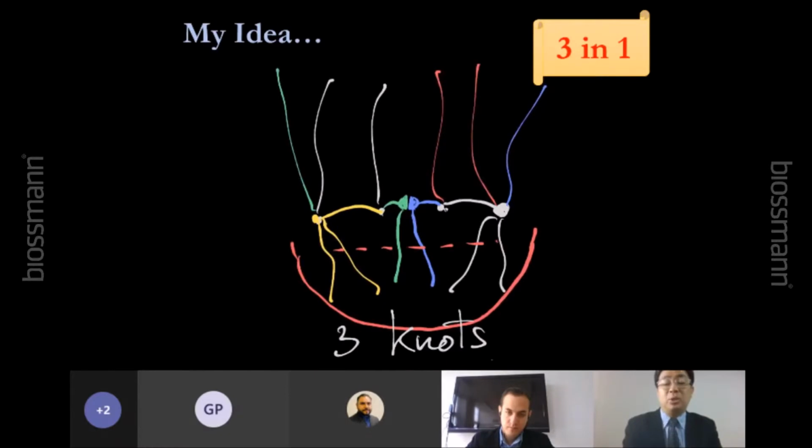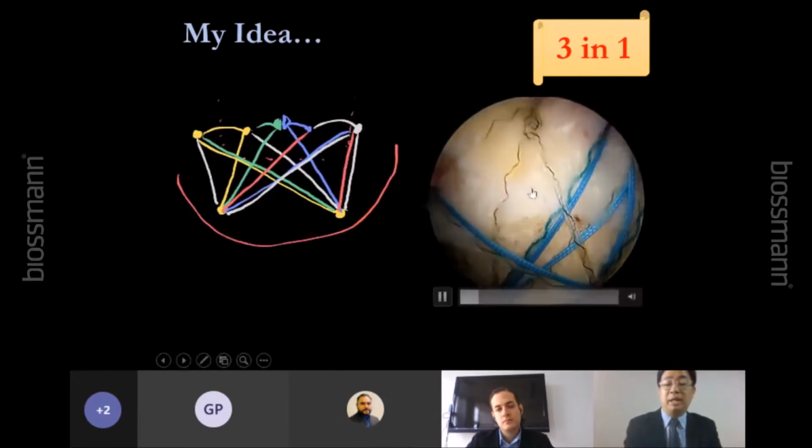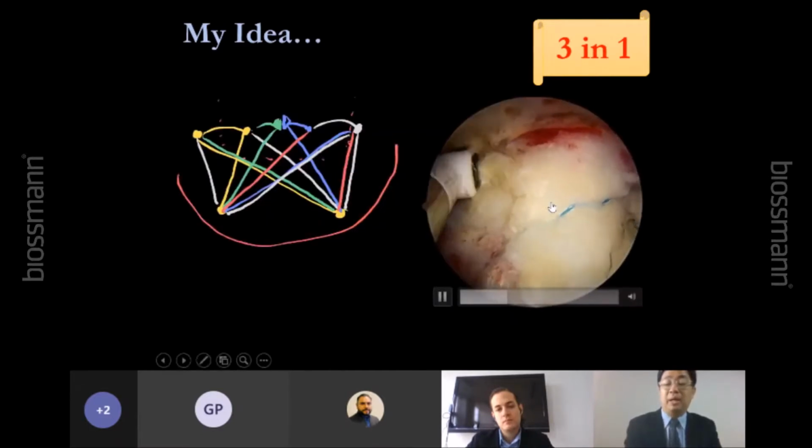And then we do the limited knot tying. We do 1 in the front, 1 in the back, 1 in the middle, only 3 knots. And then we do the suture bridge this way, okay? So this is my idea. We call it the 3-in-1 hole hybrid technique. So this is after the repair, okay?